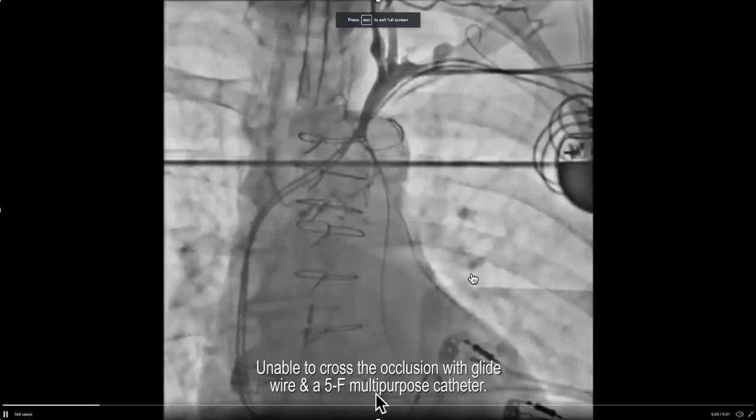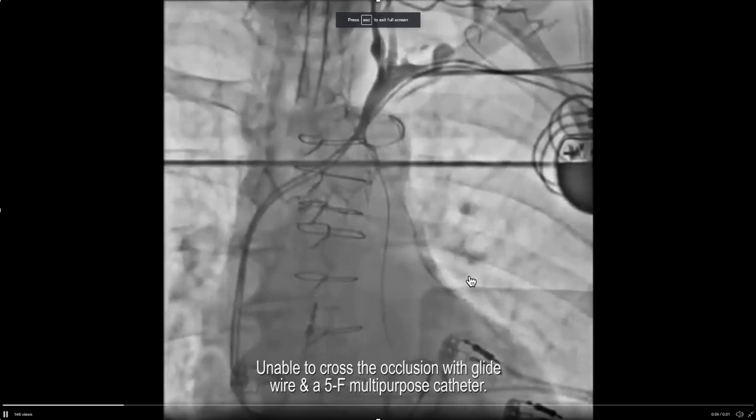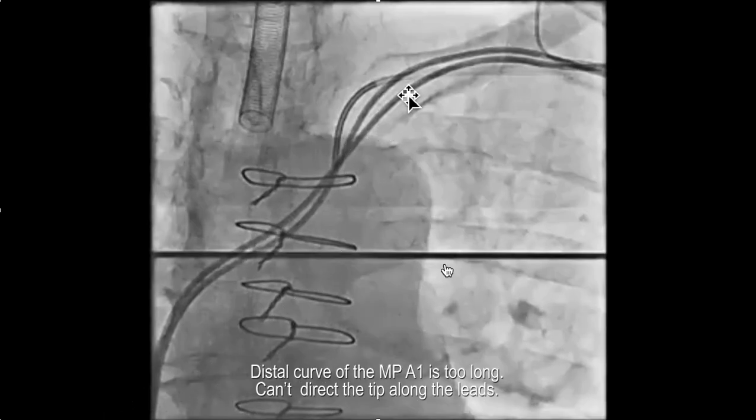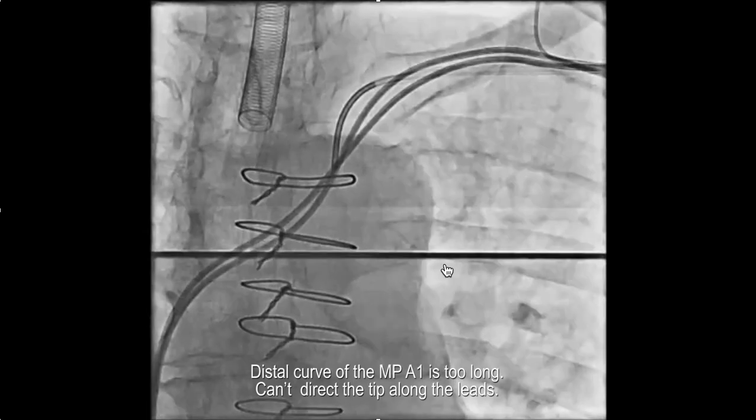The shape of the catheter used to cross an occlusion is illustrated in this case. There was an occlusion and the physician trying to cross it used an MPA1 catheter — a 5 French MPA1 catheter — to try to cross the occlusion. We all did this in the beginning because it was readily available in the cath lab.